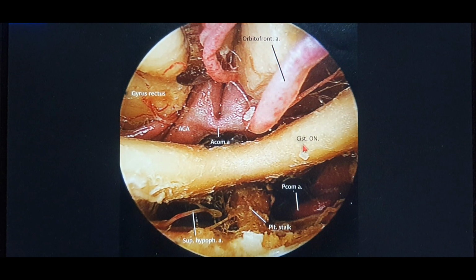This is the optic nerve, that's the optic nerve, that's the optic chiasm. We were right here, this is the pituitary gland, that's the pituitary stalk. Now, above at this level, we can get the anterior cerebral artery and the posterior communicating and the posterior cerebral artery above the level of the pituitary gland.